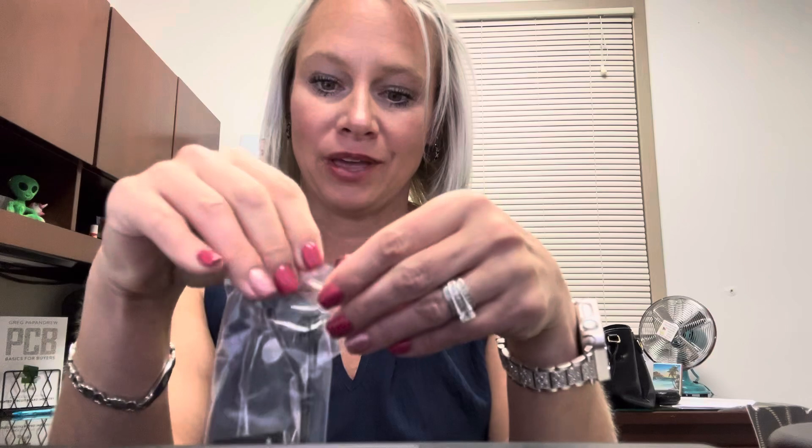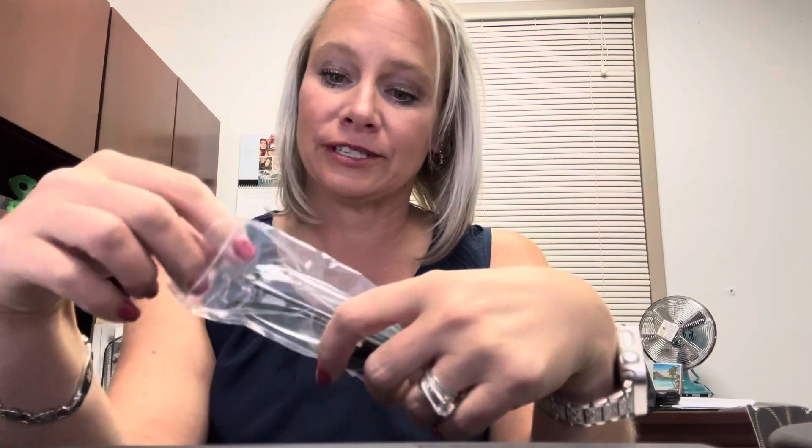It's nice that they come in packs of four because I can leave one at work, one at home, one in my car, and one in my purse. So I'll always have them.